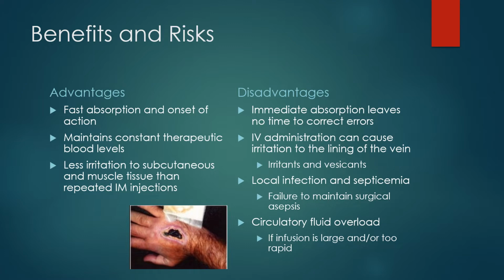Failure to maintain surgical asepsis could lead to infection or septicemia, right? We're putting it right into that vein, which goes into our blood system. If the infusion is large and rapid, the patient could become overloaded very quickly.